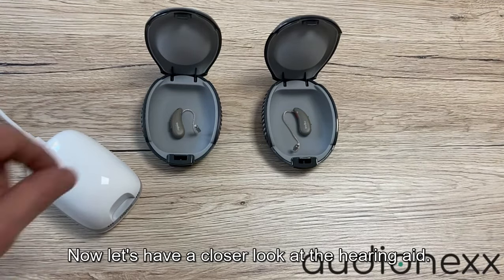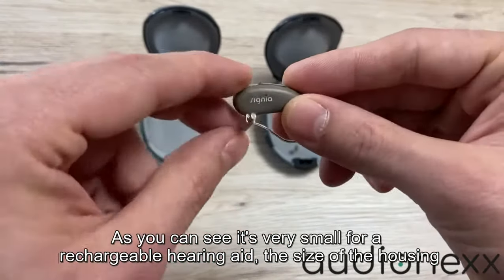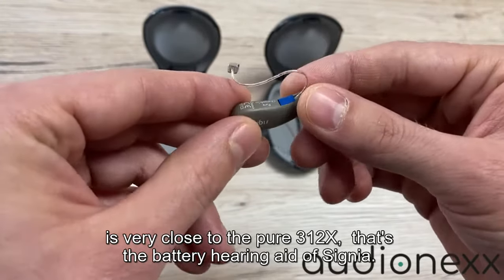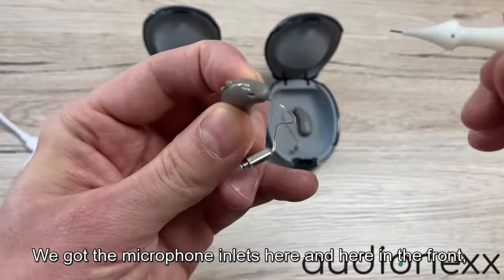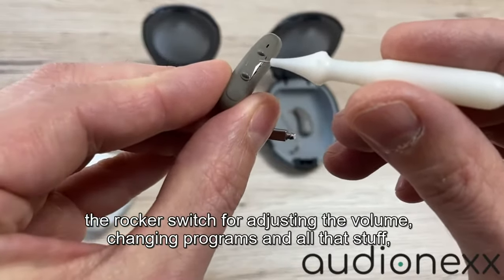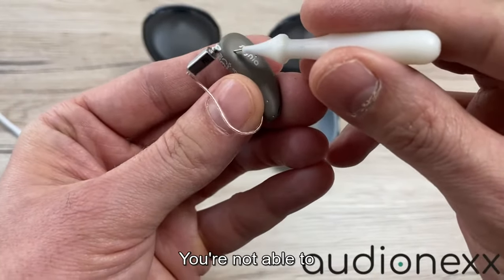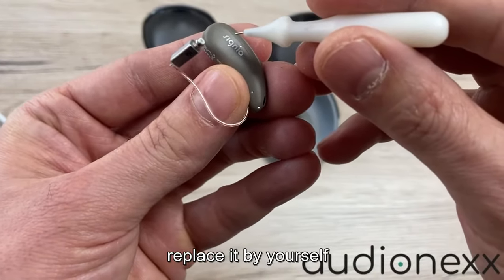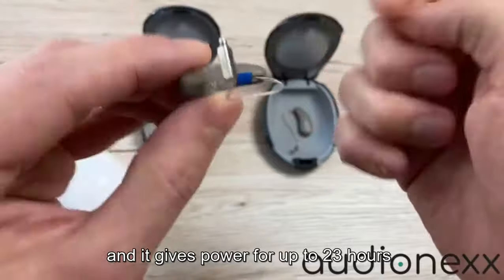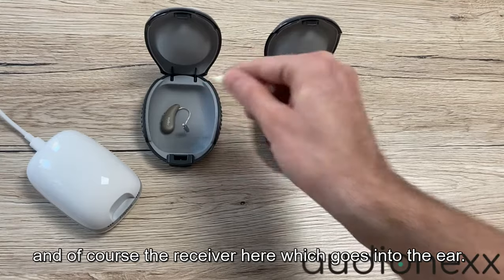Now let's have a closer look at the hearing aid. As you can see, it's very small for a rechargeable hearing aid — the size of the housing is very close to the Pure 312X, which is the battery hearing aid from Signia. We get microphone inlets here in the front and one in the back, a rocker switch for adjusting volume and changing programs. It has a built-in rechargeable battery you can't replace yourself, and you don't have to — it should last many years and gives power for up to 23 hours. And of course the receiver goes into the ear.